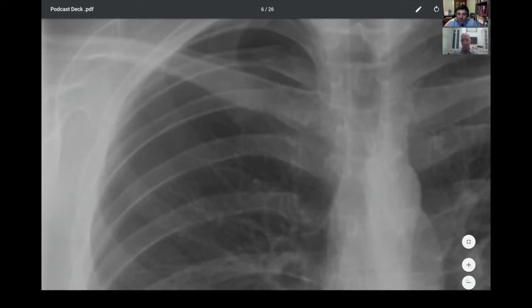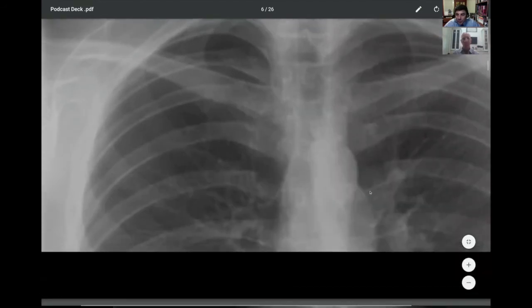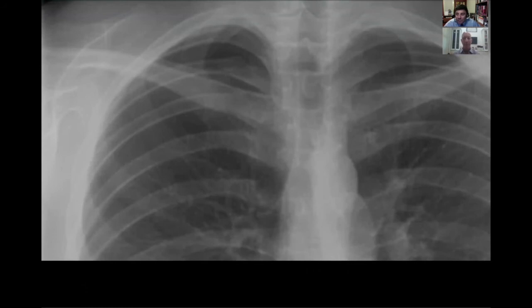Are there any things that you can do? A lot of us have digital PACS readers and stuff like that. There are some techniques of changing the gain, going from negative to positive, in order to pick these out. Are there any tricks that you guys use, or is it just on the basis of seeing what's normal, what's abnormal, and just being very, very meticulous and trying to look at each of the different lung fields to make sure that there's symmetry in the lung vessels going out to the periphery?